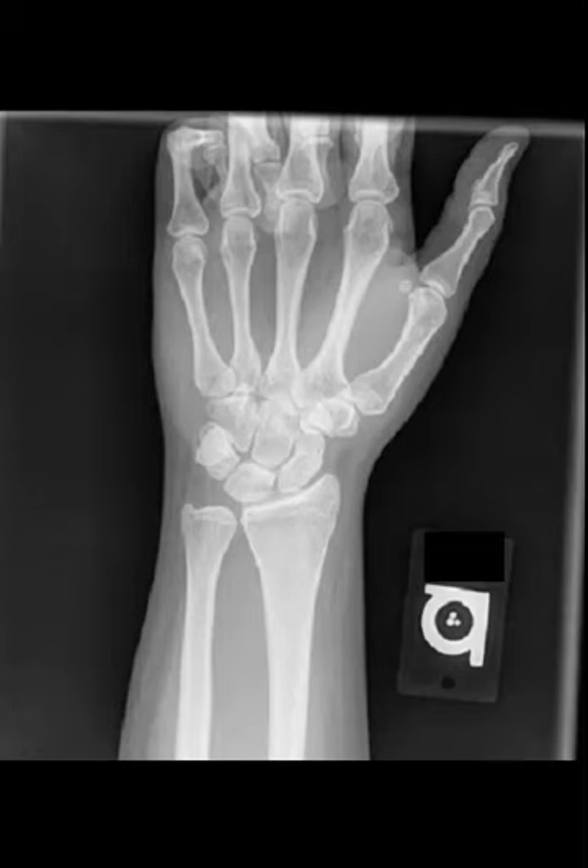Welcome back. Today we're going to do the normal standard projections of the wrist, in this case the left wrist. Notice the left marker. This type of radiographic marker is called a Mitchell marker.